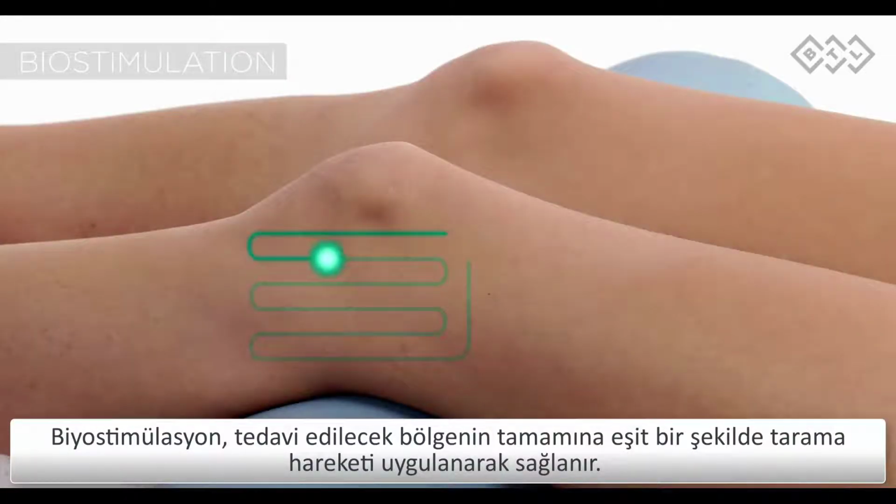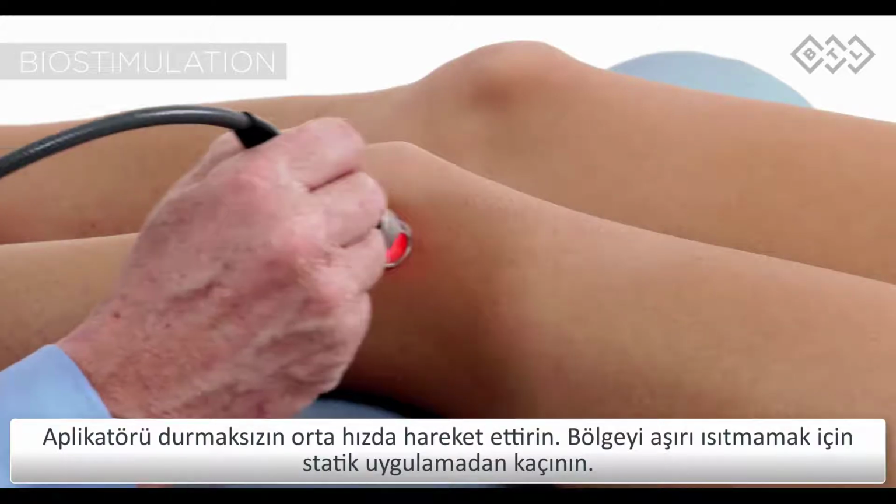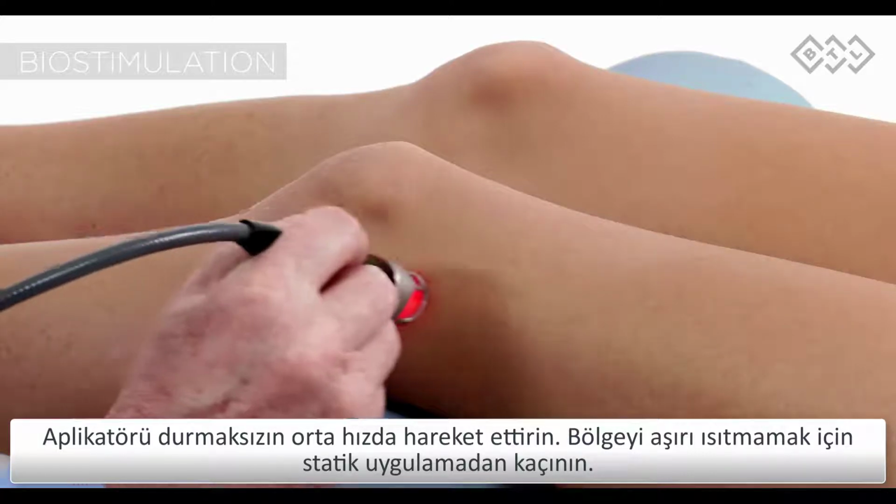Biostimulation is delivered by scanning across the treated area, covering the whole area evenly. Move the applicator continuously at medium speed. Prevent static application in order not to overheat the area.